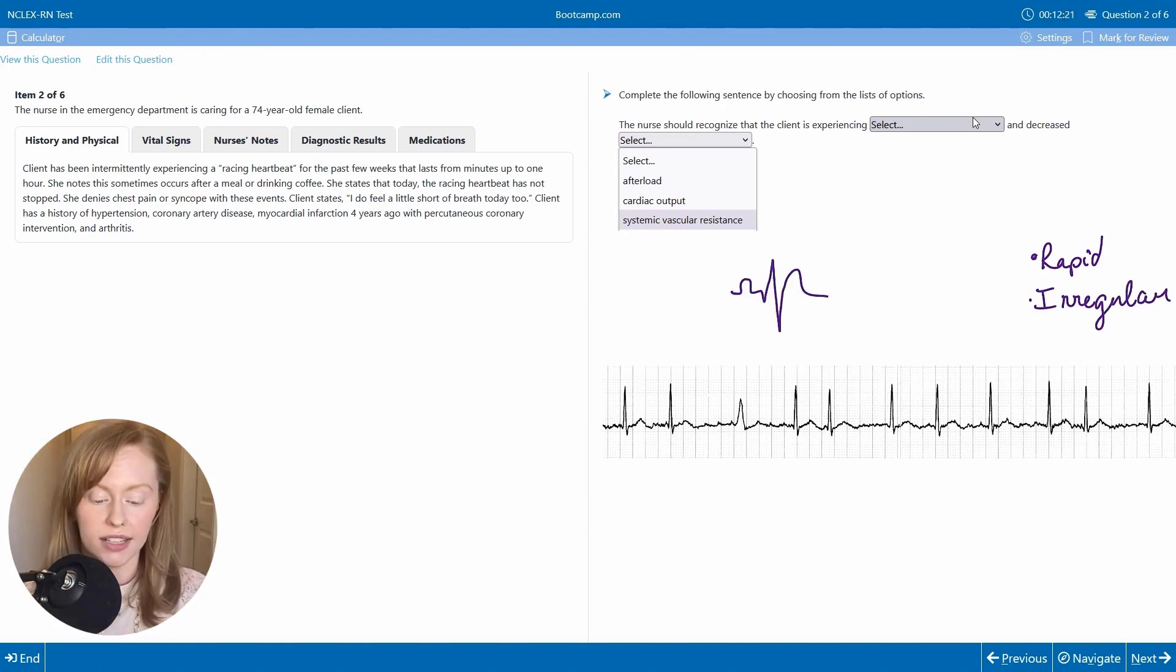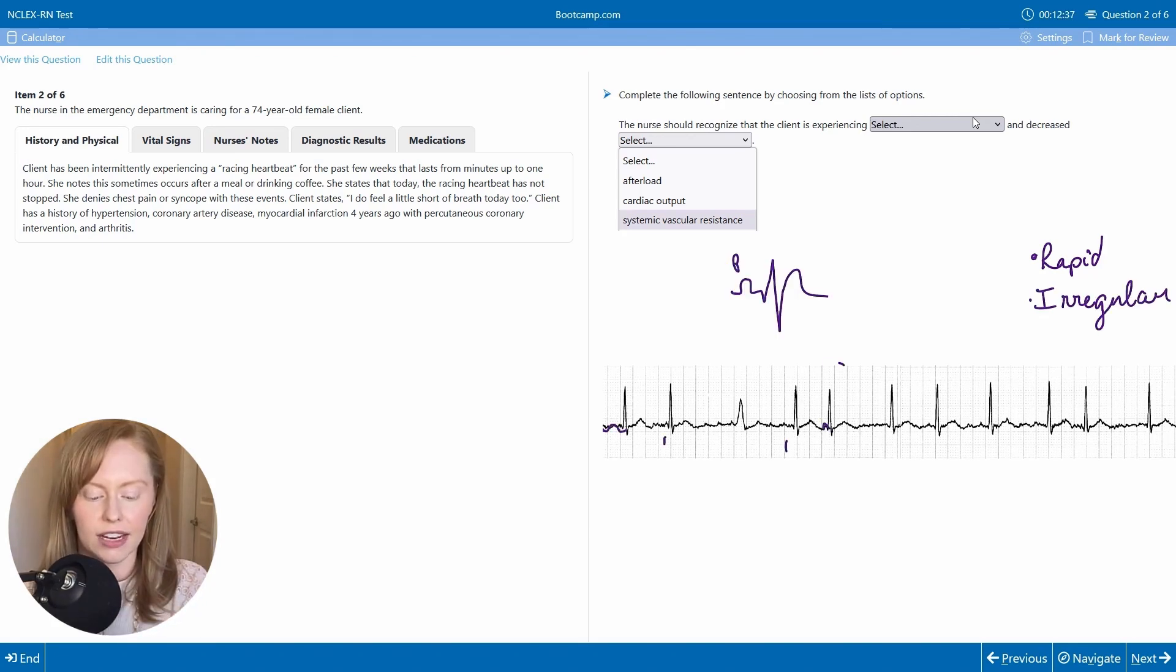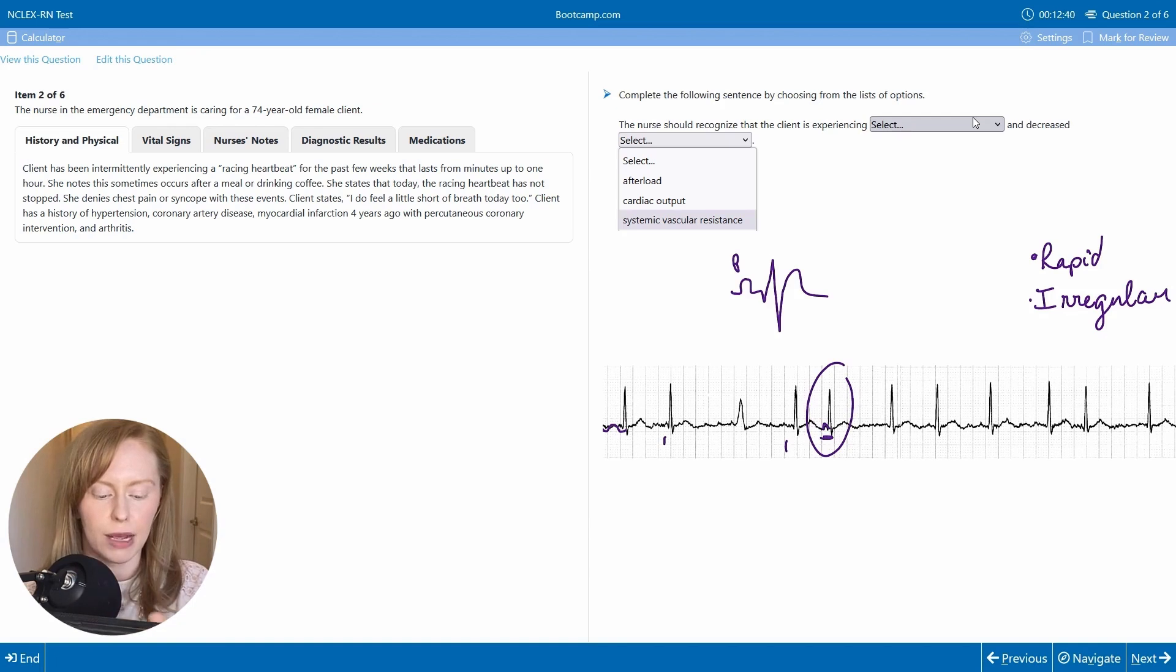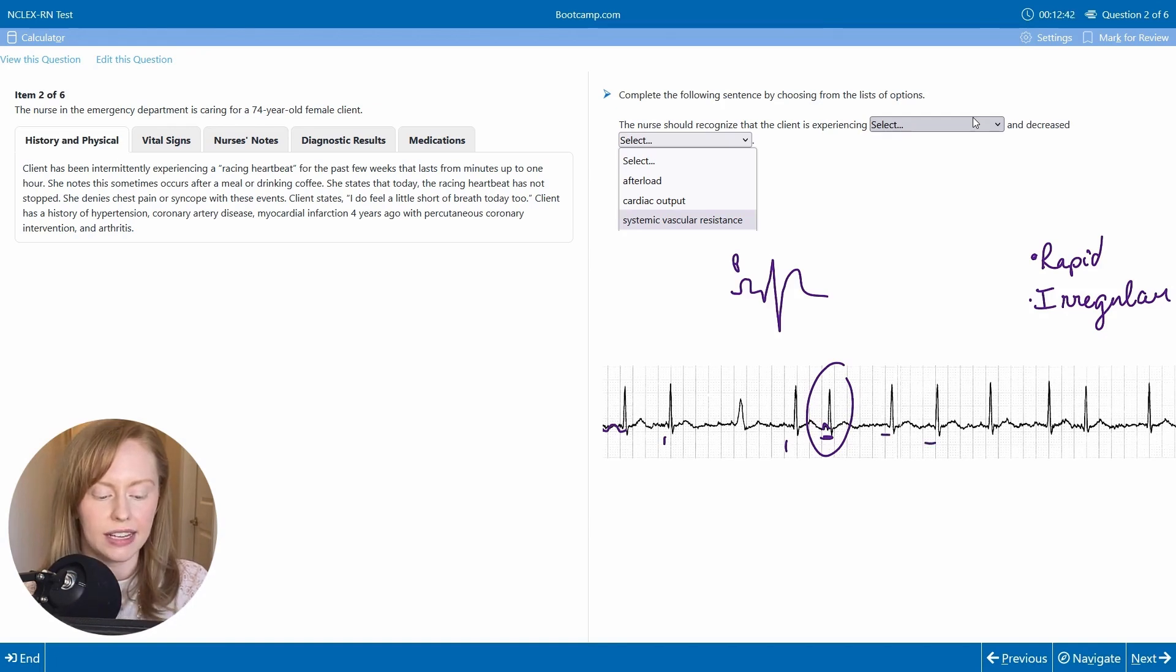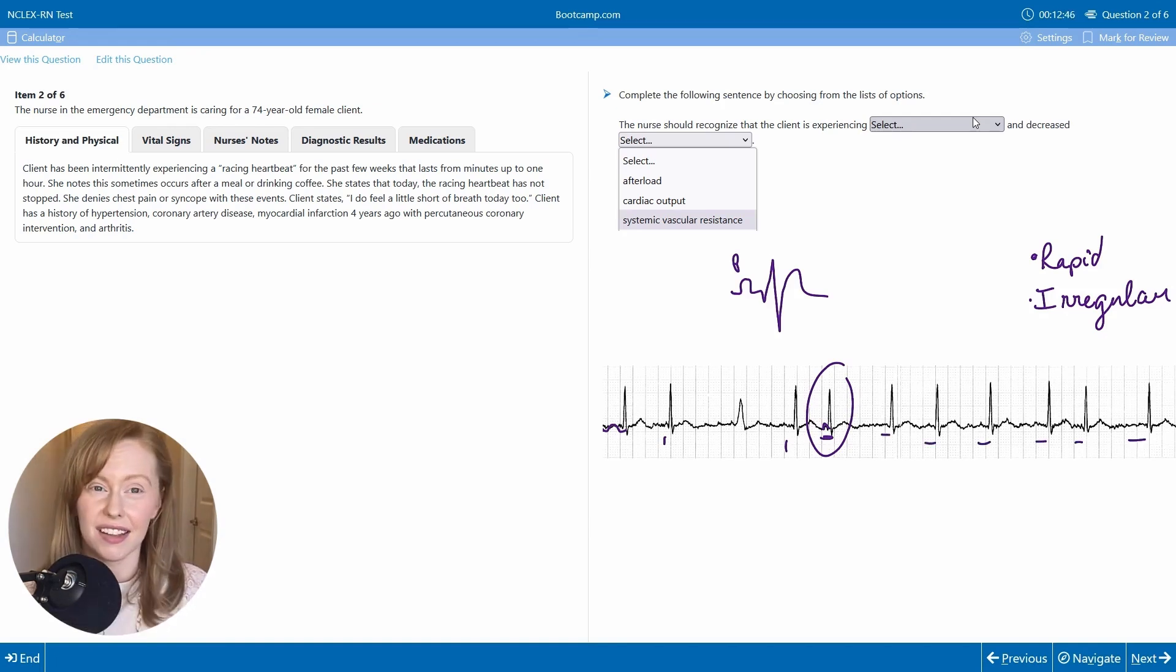Next, do I see P waves here? Even if I can convince myself that that might be a P wave, I'm not seeing something consistently that I can say I have a P wave.